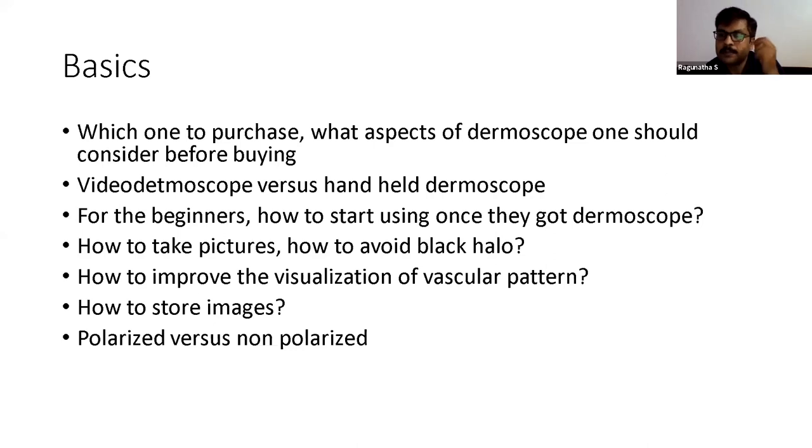Well, I think in the learning stage, definitely we should be capturing images both in the non-polarized as well as the polarized mode. As we advance, and we are more comfortable with the features, and we know that a particular condition is better visualized in a polarized mode, I would do it. But if it is something like trichoscopy, I will definitely do it in both the modes. If it's something like inflammoscopy, I will definitely do it in both the modes.